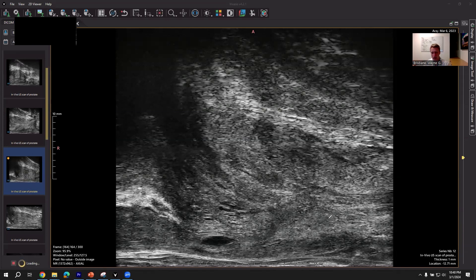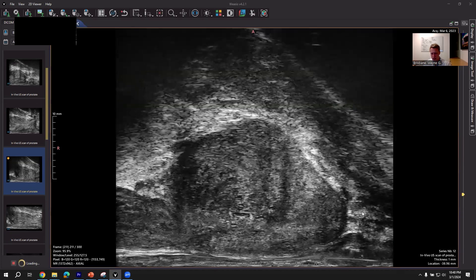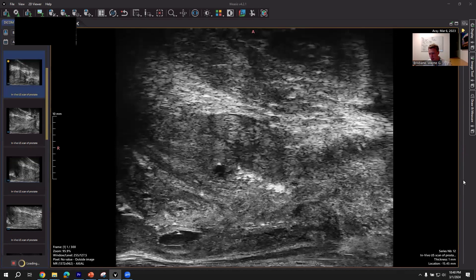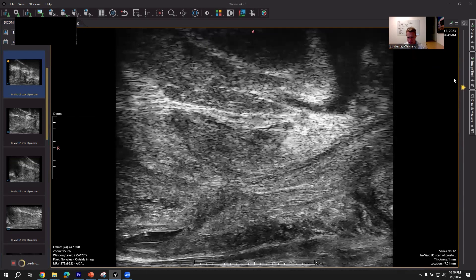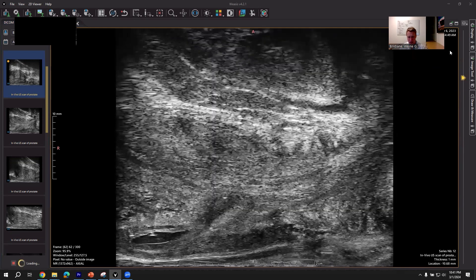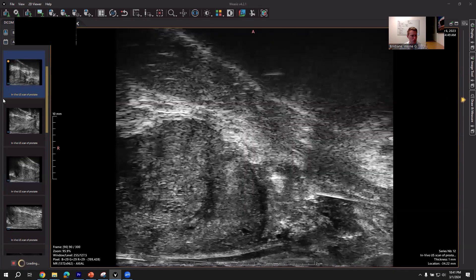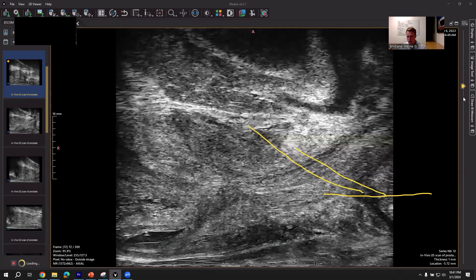After that, you're going to be doing your anesthesia. The anesthesia needs to be in that periapical triangle — here's kind of the periapical triangle right here. The way I think is best to get this in: so you can see here, instead of putting this needle straight through the muscle — you can see this muscle going right down there — instead of going straight through the muscle, what I would do is come in right here, so that the muscle is not visible.